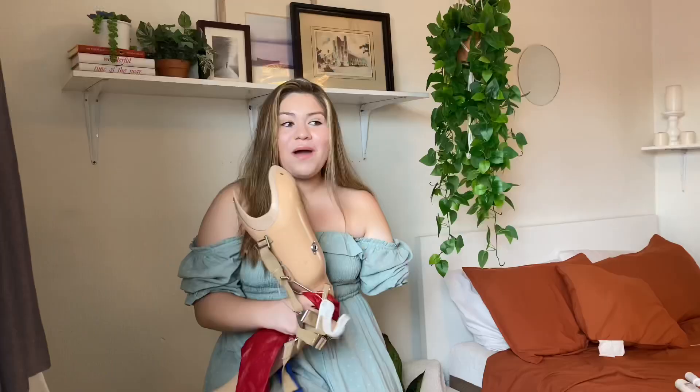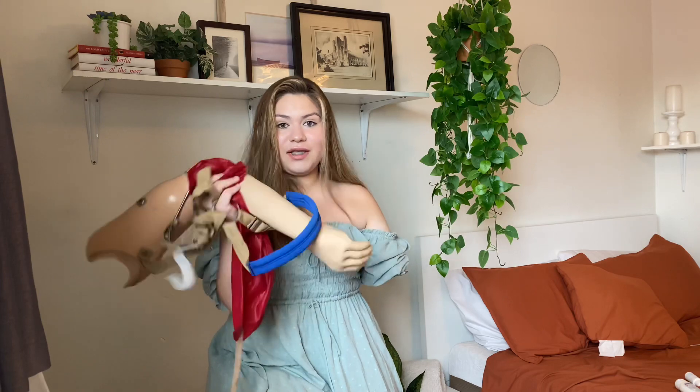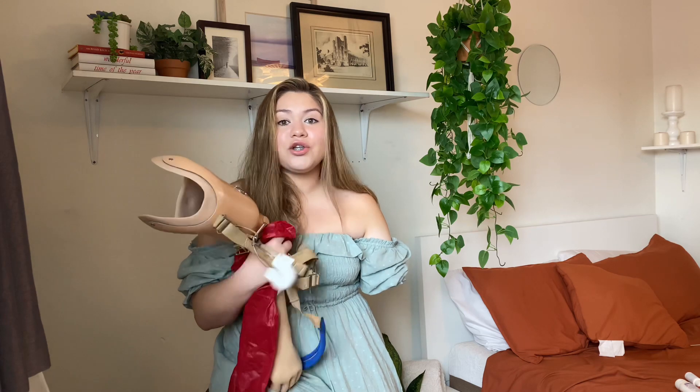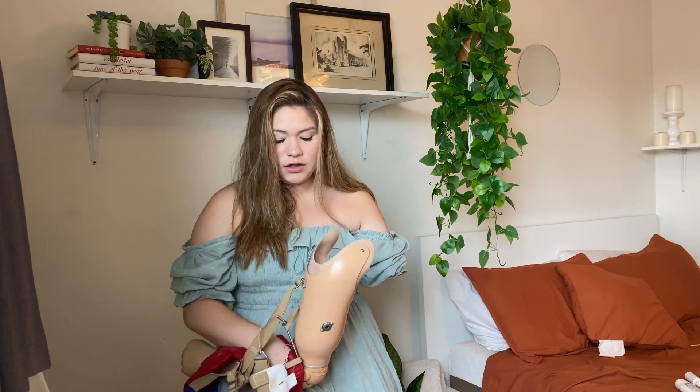Hello, welcome back to my YouTube channel. Today I'm going to be showing you how I literally put this on. Many people have asked me how I put this on and how it works, so I really wanted to show you guys. Let's get started. So this is a body harness one — a lot of people have the robotic one.